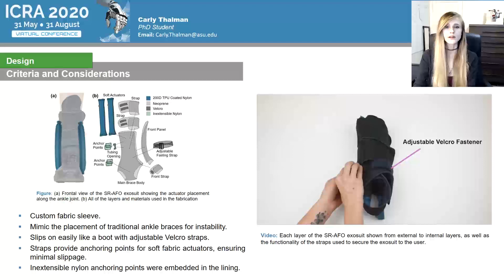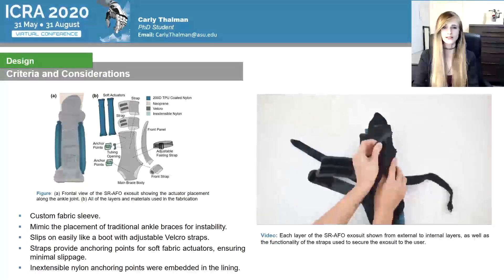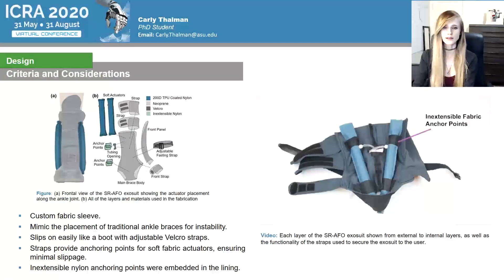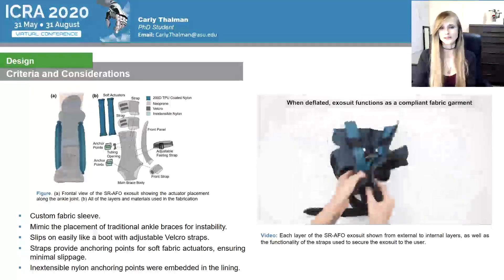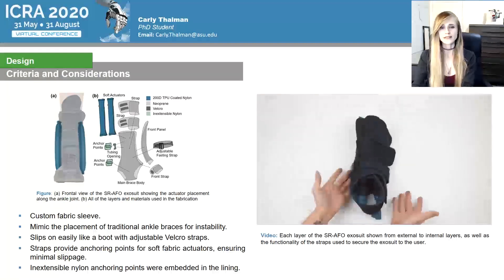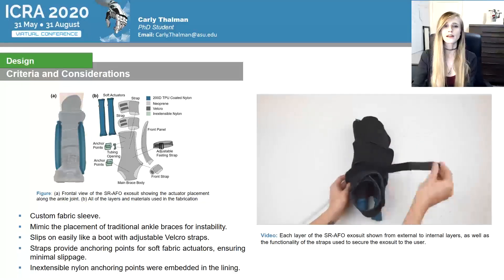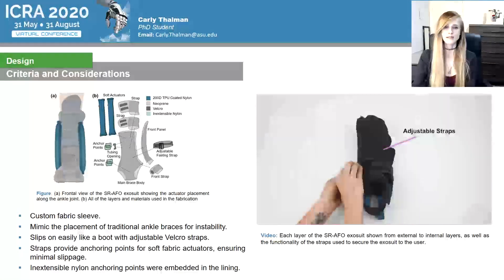The soft fabric actuators were placed vertically on either side of the ankle, starting at the base of the talus and running across the medial and lateral malleoli of the ankle to mimic the placement of traditional ankle braces for medial and lateral instability. The SRAFO exosuit slips on easily like a boot and the don and doff time is minimized by using an adjustable velcro strap which holds the exosuit with a snug fit around the ankle joint. It still allows for comfortable and natural movement while worn. The exosuit was designed as a one-size-fits-all device and adapts to the foot size of most adult subjects. Inextensible nylon anchor points were embedded into the lining of the neoprene sleeve and hold the actuators in place at the top and base of the actuator.